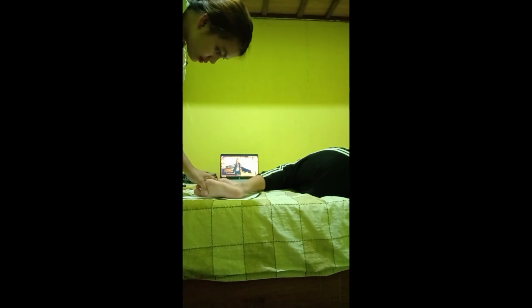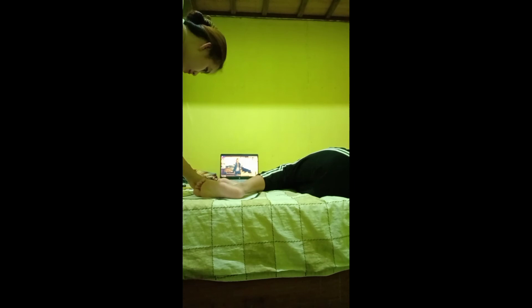The longitudinal axis of the patient's foot is still parallel to the longitudinal axis of the IR. The central ray is perpendicularly directed entering the base of the patient's third metatarsal.